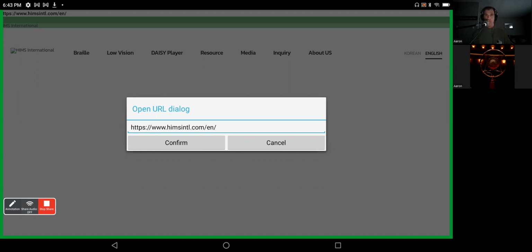Now, you have to be careful how you write your address, because sometimes it will work, sometimes it won't. You always have to double check that. Sometimes you'll have to put the www and sometimes not. So let's see how this works. Let's just go to apple.com. Make sure I'm in contracted braille, not computer braille. Edit combo box. Let's go to .com.